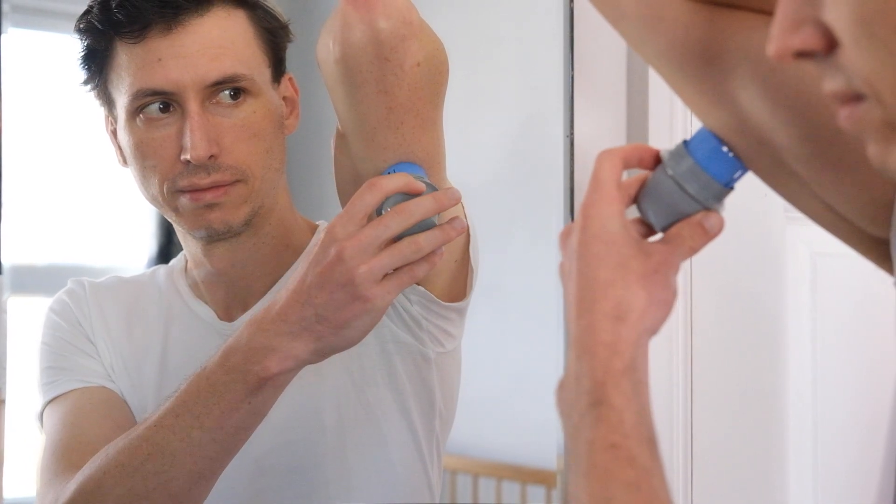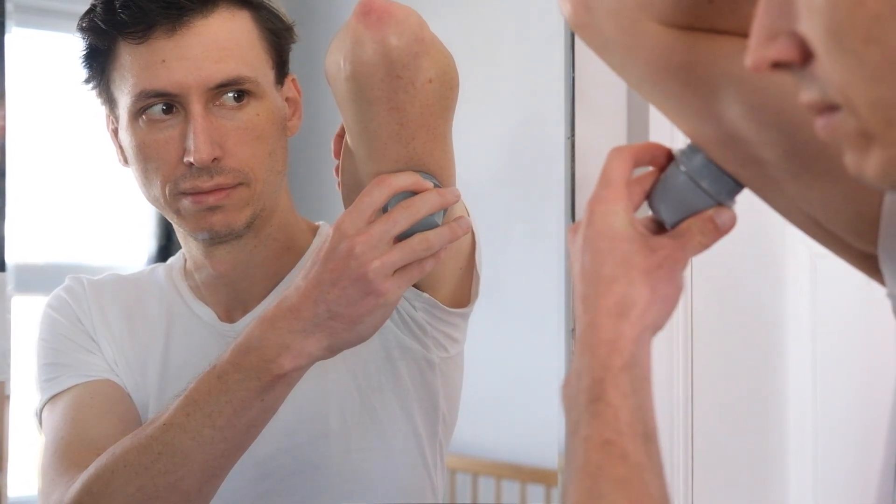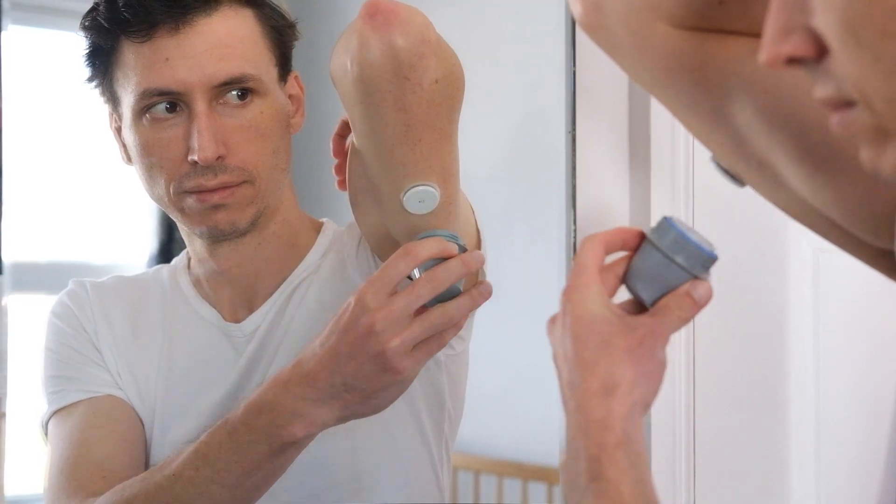Each CGM comes with a disposable application device which uses a retractable needle to insert the wire underneath the skin. Patients with impaired dexterity may find these tricky to use. The sensor is held to the skin with adhesive. Some of the older models need calibration — to do this, patients will finger prick once or twice a day and enter this data into the reader. To remove the CGM, you simply peel the device off the skin.